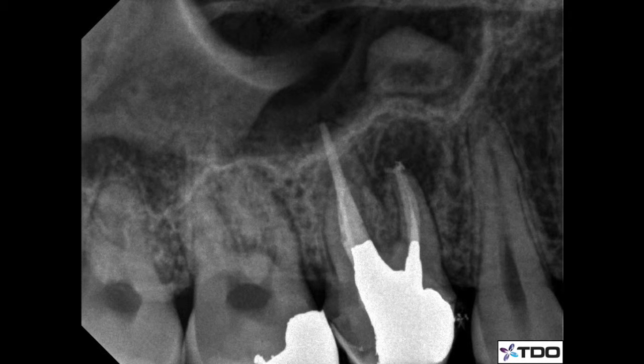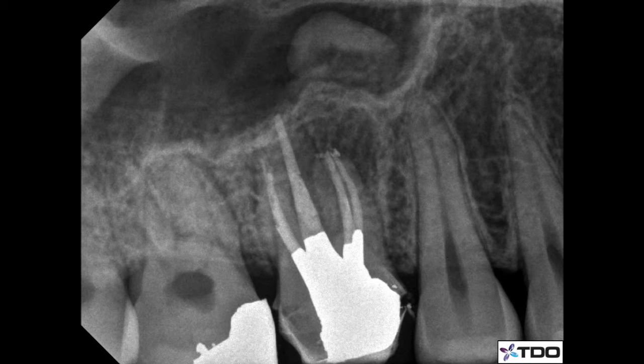Two visits to complete this treatment. Amalgam buildup was placed after the root canal was done — controversial, yes, but they didn't need a post, and I wanted to have something strong in there. The prep looks nice. I roughed out the crown prep and the temporary crown stayed on again — always nice. The patient is now back with the dentist, ready for the new crown.